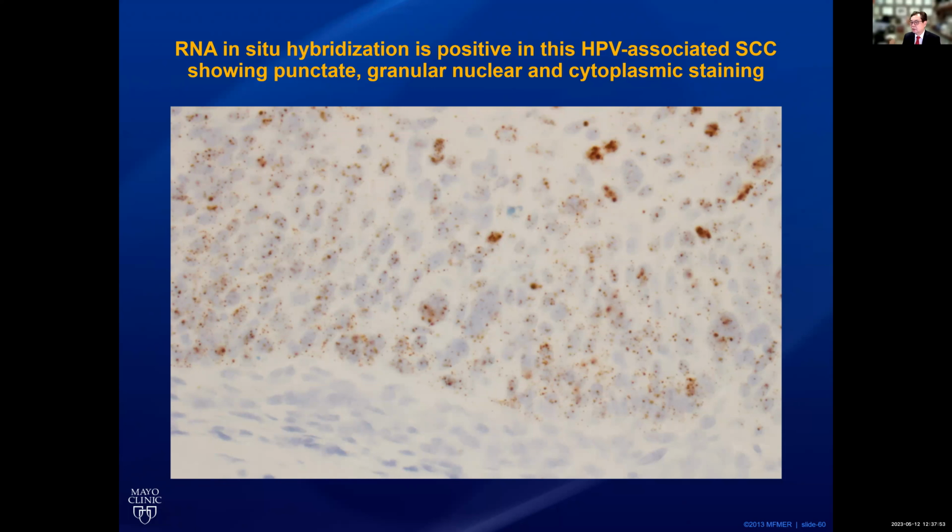What they have done is, as we know, usually when you increase sensitivity, you decrease the specificity. But they use a very novel technology to amplify the signal and yet remain very specific. So both specificity and sensitivity are very high. And Mayo Clinic, Hopkins, almost every major institution are using this technology we call RNAscope. I happen to know the investigator of this company, and it is a very nice technology.